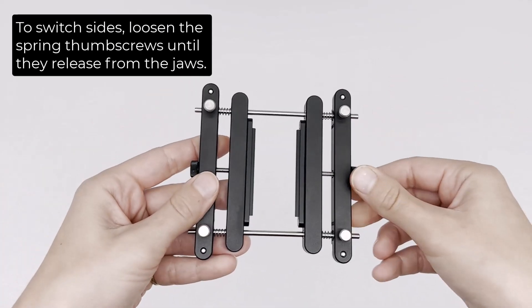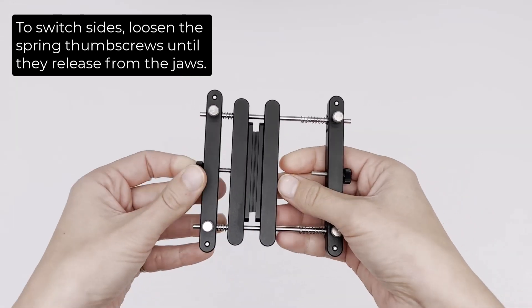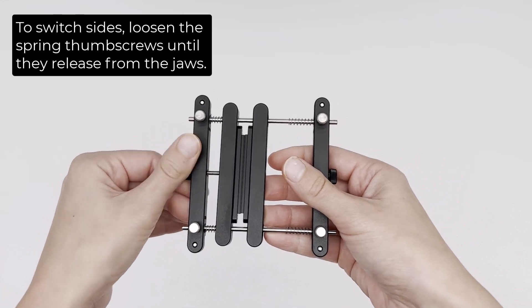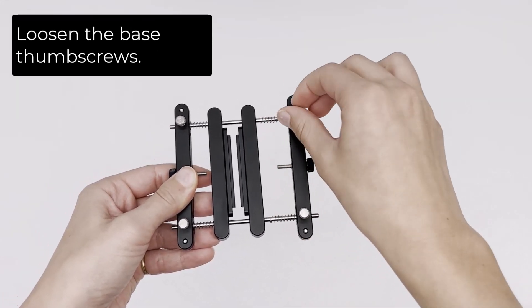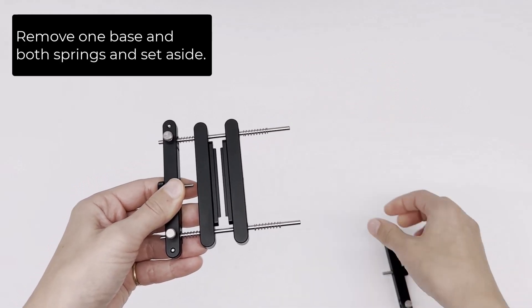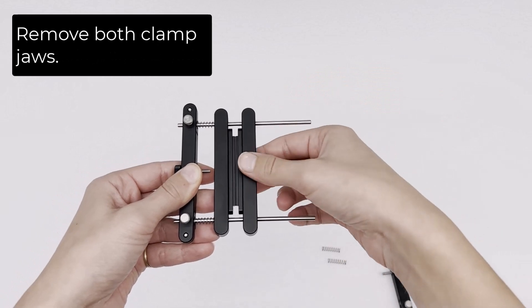To switch sides, loosen the spring thumb screws until they release from the jaws. Loosen the base thumb screws. Remove one base and both springs and set aside. Remove both clamp jaws.